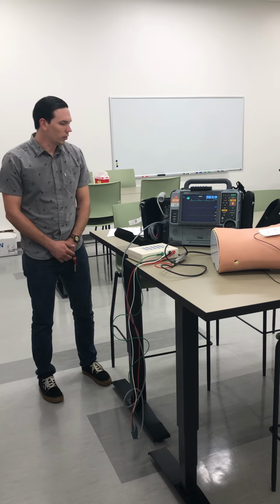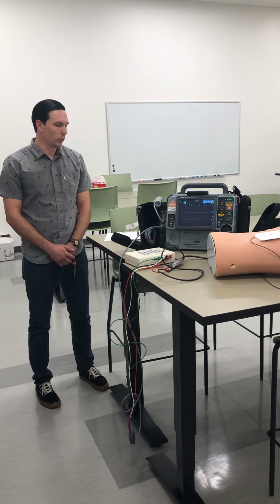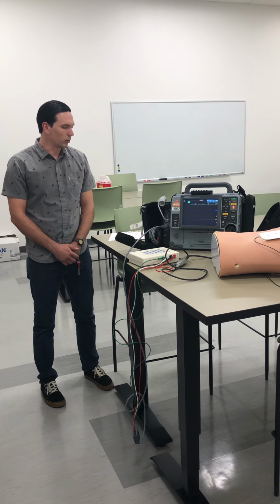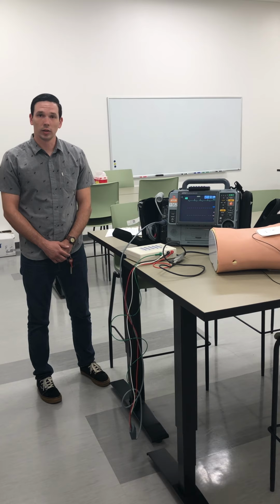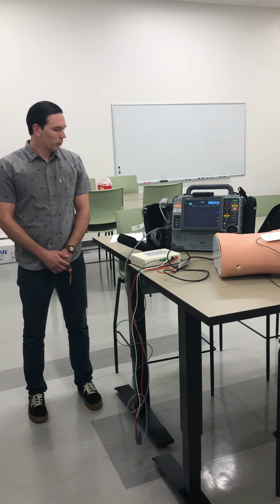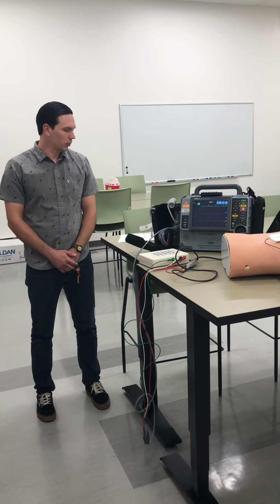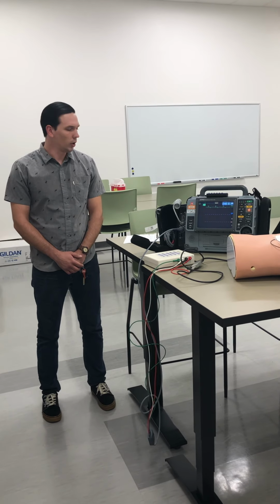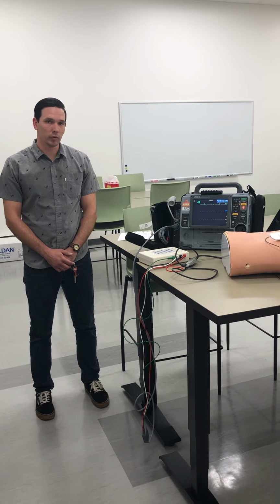Transcutaneous pacing is a temporary means of pacing a patient's heart rate during an emergency and stabilizing the patient until a more permanent means of pacing is achieved. Transcutaneous pacing is accomplished by delivering pulses of electrical current through the patient's chest, stimulating the heart to contract. The indications for transcutaneous pacing are symptomatic bradycardias, sinus node dysfunctions, heart blocks, along with conditions such as hemodynamically unstable patients with chest pain, pulmonary edema, bradycardias unresponsive to atropine, and altered mental status.